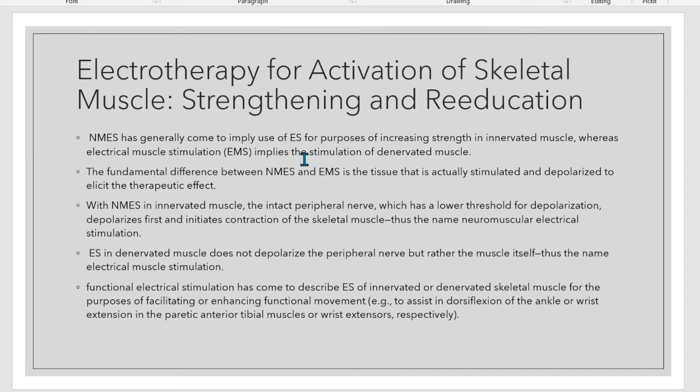Kay nagka-fracture ka sa supracondylar ridge. So therefore you have wrist drop. So wala kay wrist extensor. So sa pag-grip nimo sa baso, di ka maka-grip sa baso. Try ninyo nga wala kay extension, naka-wrist drop ka, i-grip ang baso. Pwede ba? Dili, no? Weak siya. So, dira, butangan dayon siya og functional ES para ma-extend ang wrist para ma-increase ang tenodesis reaction sa flexor group o muscles para mas kusgan ang gripping sa baso. Okay, so inana na siya.